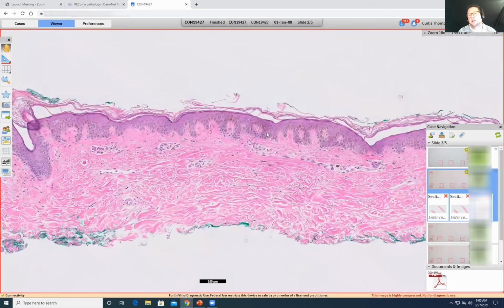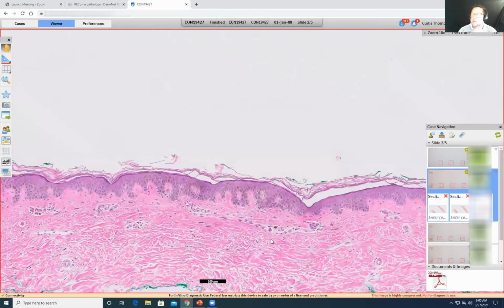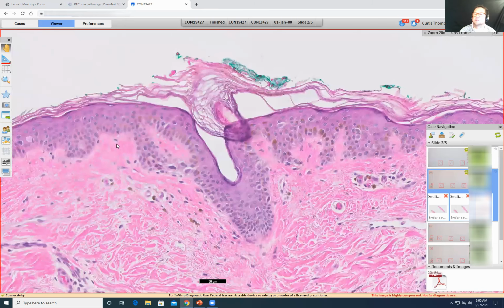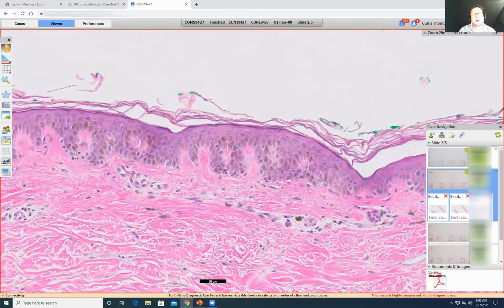And so we have a pigmented lesion. We found it C-shaped, not very standing out as very many melanocytes. So one of my concepts is that if you can't find the melanocyte, it's not melanoma. Just as if you don't have lymphocytes, it's not lymphoma. But you do start to see these melanocytes here, a little bit plump, but not terribly large. And you can appreciate that they're not confluent.